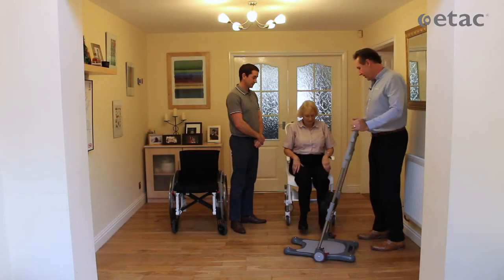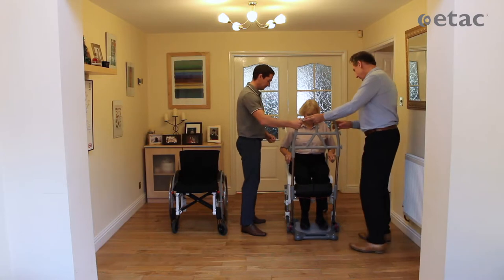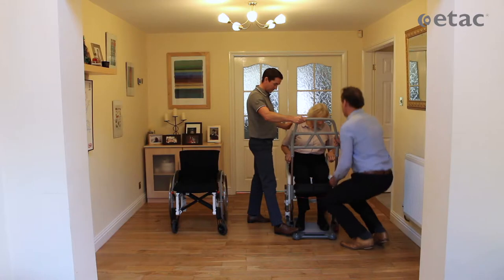Okay Karen, Adam and I are going to use the MoLift Razor Pro to transfer you from your shower chair over to your wheelchair. Just pop that in, get the brake set, and make sure the leg supports are at the right height.